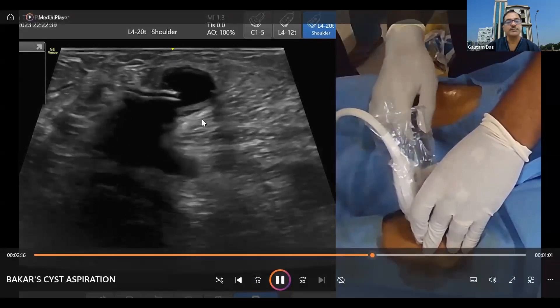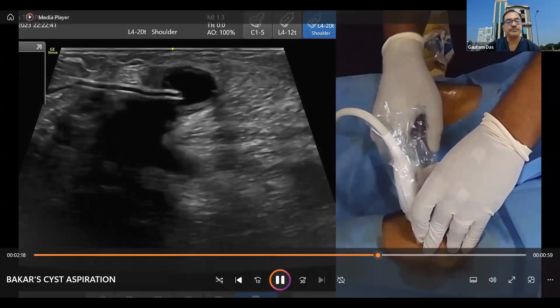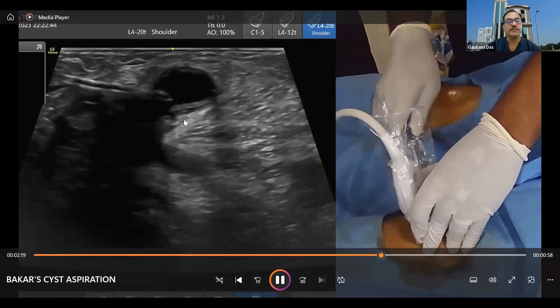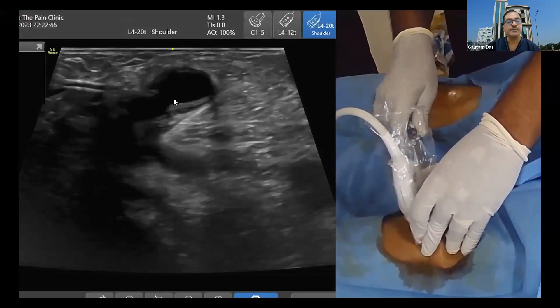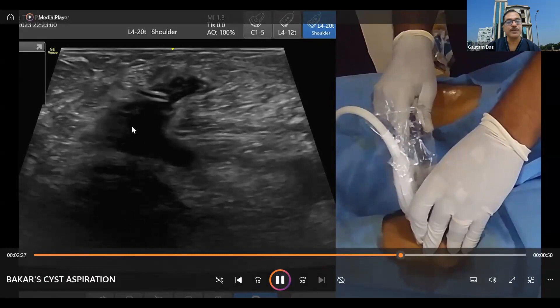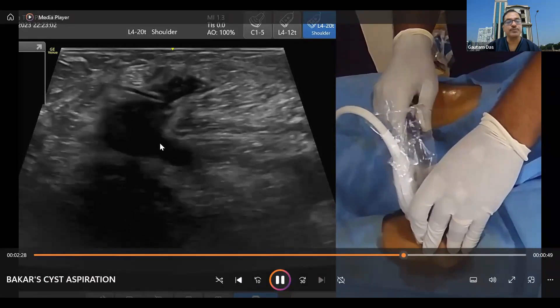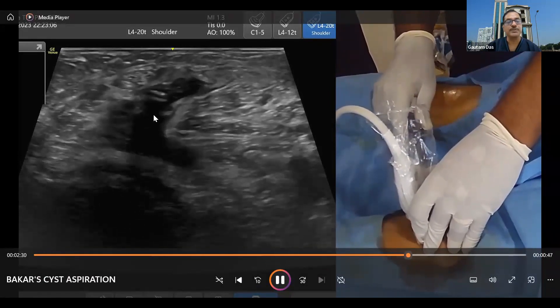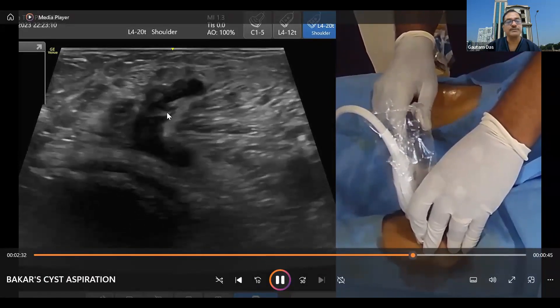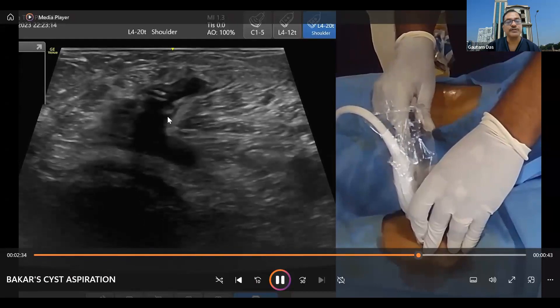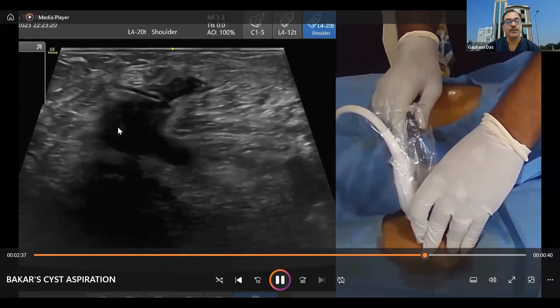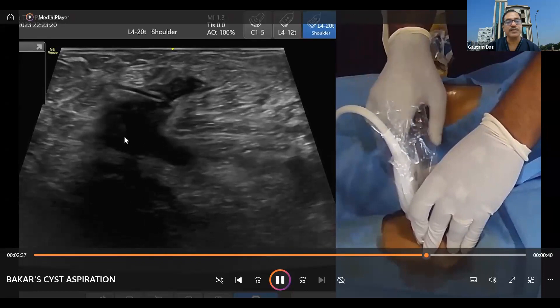We are aspirating. Remember there is a septa here — this part is taken care of, but you can see this other part — the fluid is not coming because of the septa. So what we did: we redirected the needle below into this part of the sac.